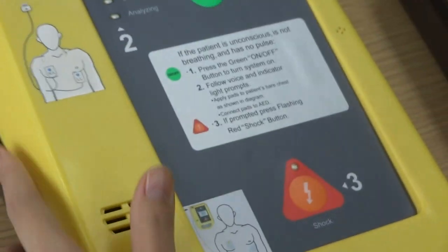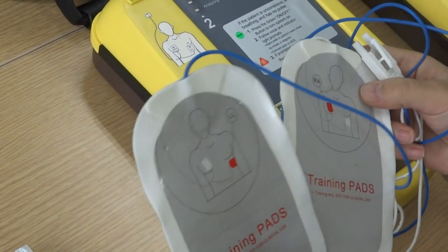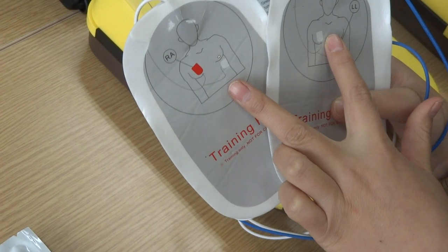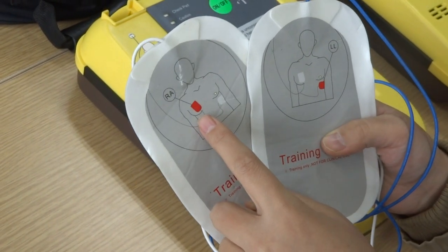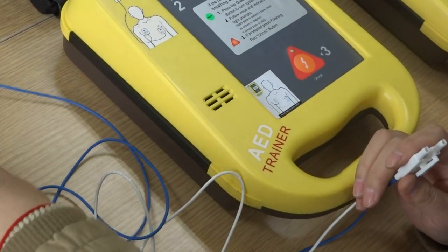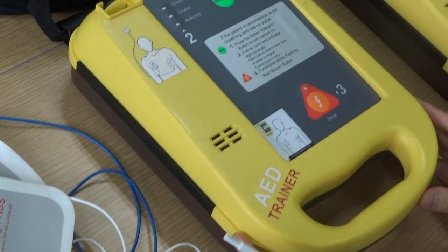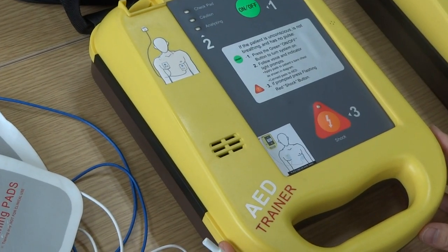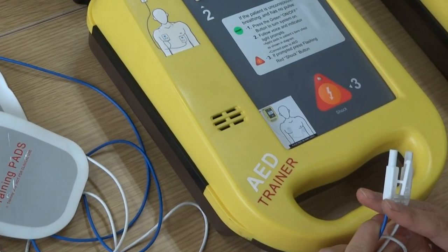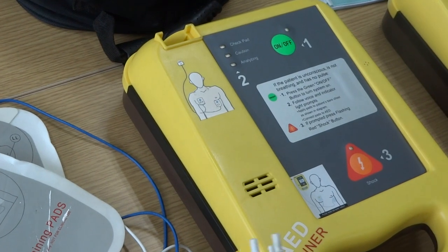Now we can run the operation. First, we need to paste these two pads on the patient's body. The pasting must follow the two picture indicators, meaning we must find the accurate locations on the patient's body. All operations will have a voice prompt, and the emergency staff must follow the voice prompting.